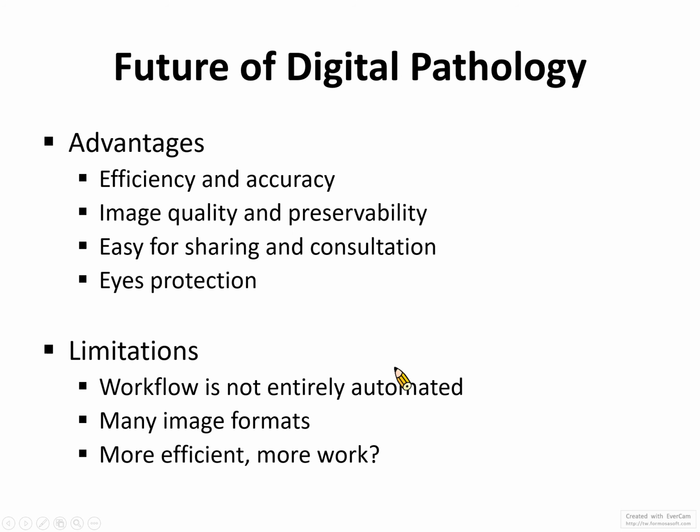And overall, we need to evaluate whether digital pathology can really improve our efficiency, or whether we actually do more work because we need to digitize everything. Okay, but based on these lectures, I just want to show you a workshop on how to apply a convolutional neural network to differentiate benign tumor and cancer cells.